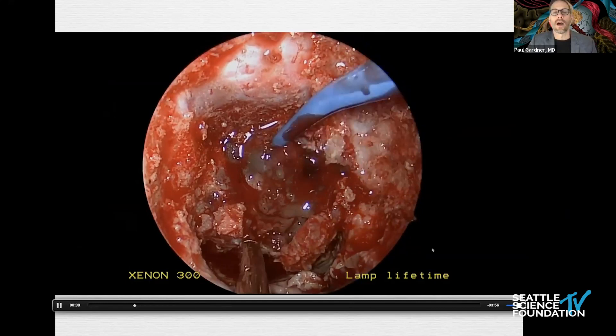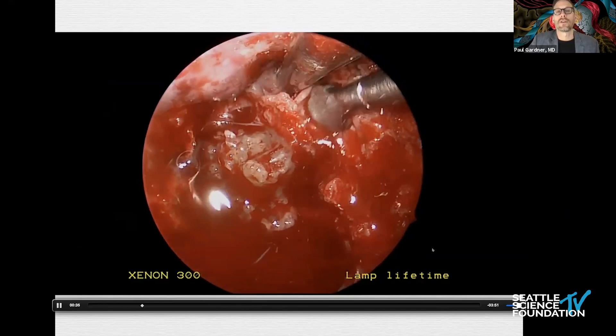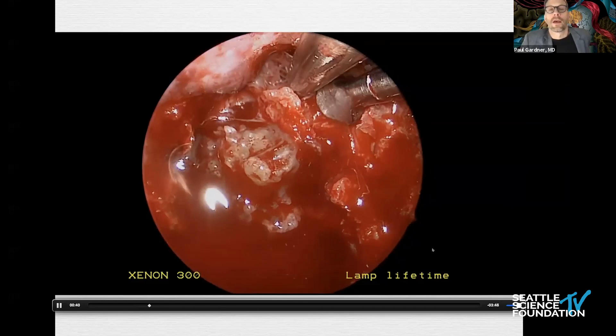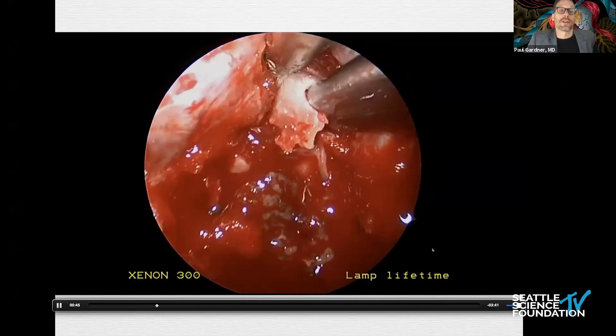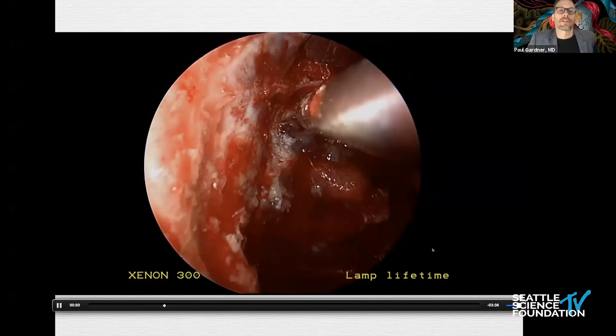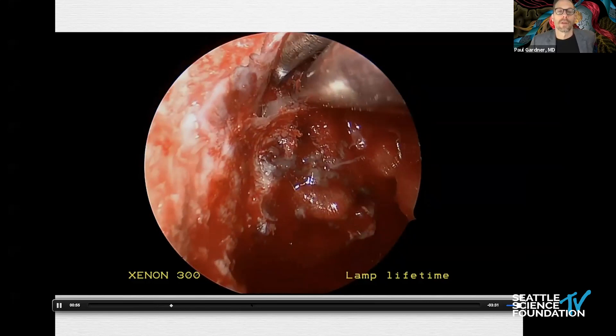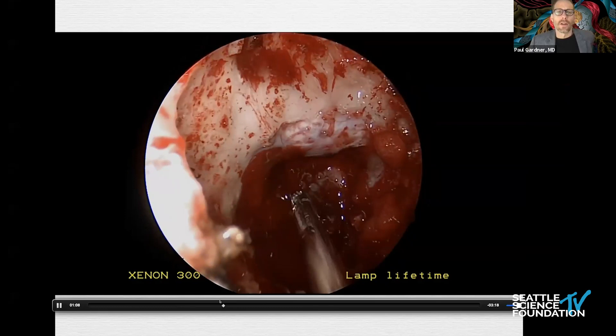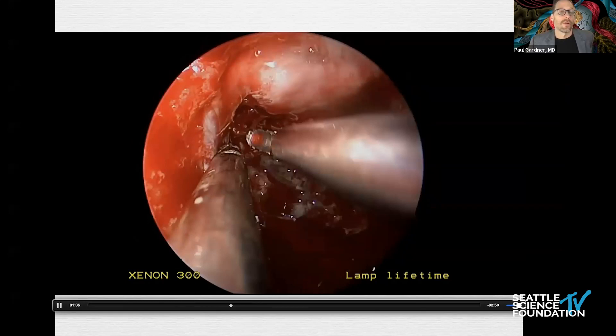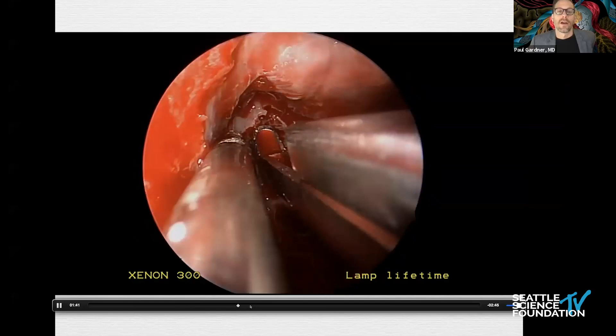A wide bony removal below the tumor is very important. Here we see a dissection above using a pituitary transposition, which I'll discuss in more depth in a moment. Here we're removing the posterior clinoid. We found that for upper chordomas, about 80% of the time the posterior clinoids were actually invaded with tumor — so if you don't remove them, you're leaving tumor behind. Wide bony removal both inferiorly and superiorly is essential. You can sacrifice the inferior hypophyseal arteries on both sides without consequence to pituitary function.